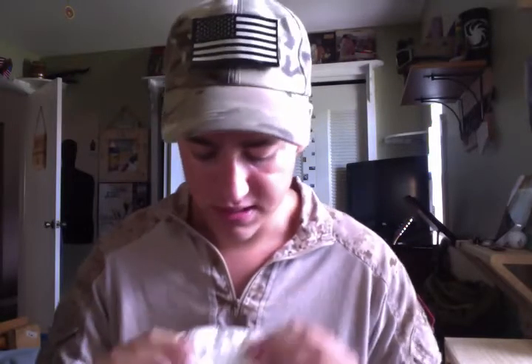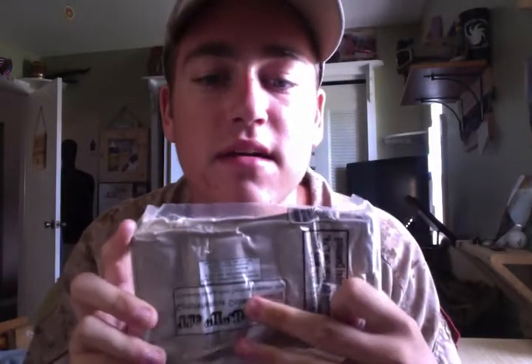Be a lot smarter. Nasopharyngeal airway. If you got something in the back of your throat and can't breathe very well, they shove that down your nose. It's got lube. Nasal lube. The H&H bandage, which is pretty sweet. I don't know if you can see the H in it, kinda.